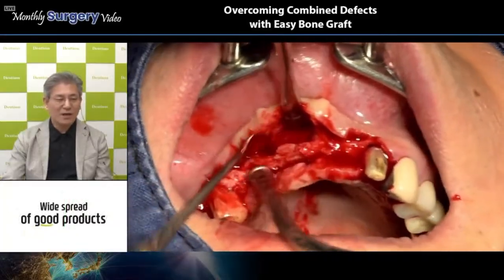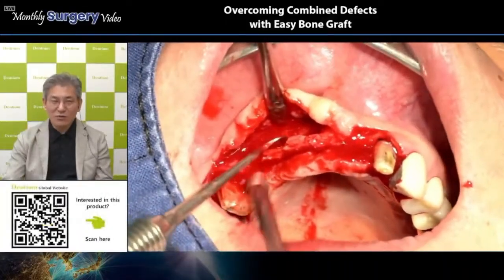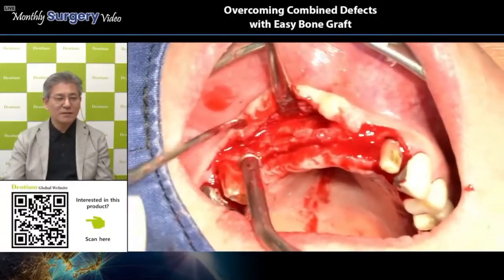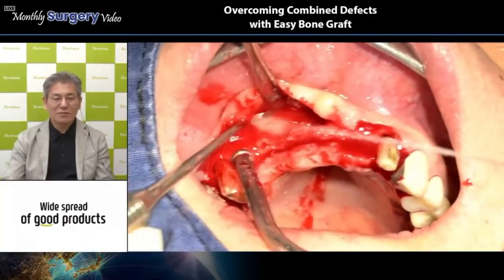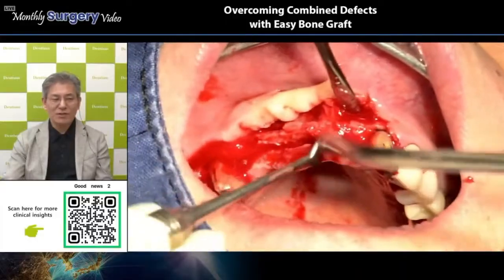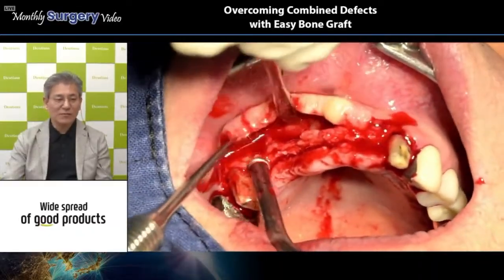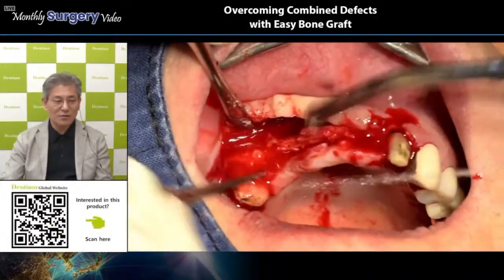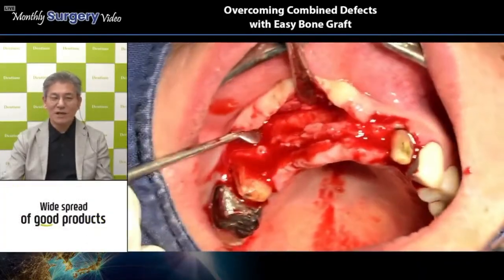Otherwise, it needs other bigger surgeries like titanium meshes or some tenting screws for the GBR procedure to make enough space. There are many difficult procedures necessary if you want to have an implantation or a bone grafting GBR procedure in this entire area. However, today Dr. Chung is showing us a simple bone grafting on this extremely narrow ridge, with implantation at a strategic position. So, a very clever approach for this elderly patient.